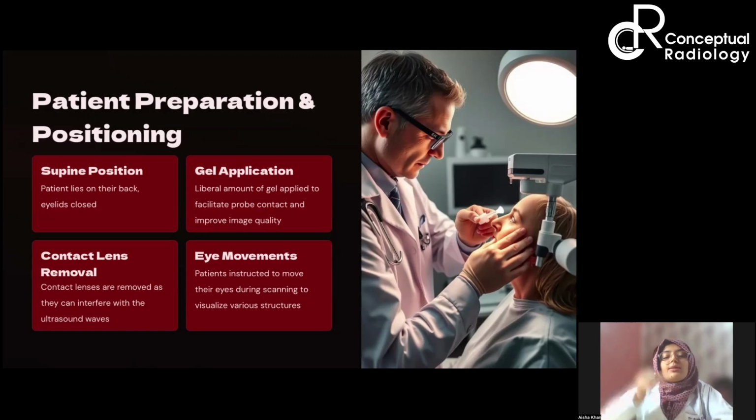ठीक है, ये नहीं कि the patient's eyes are closed and then you are saying ऊपर करो, नीचे करो, दीवार को देखो, फैन को देखो, nothing like that. Before itself you have to properly give 2 minutes, explain to them that when I will say that you have to look up, that means you have to look at the wall which is just behind. If I have to say you have to move your eyes 360 degree, to just rotate.